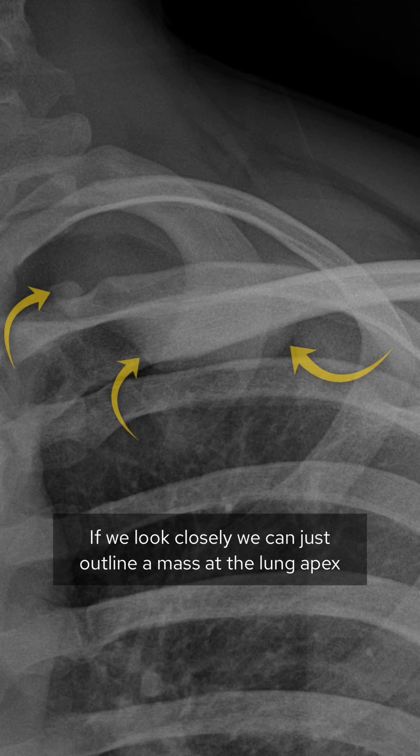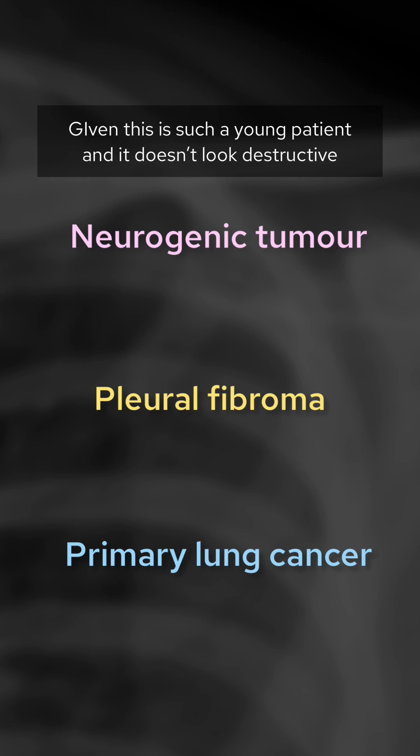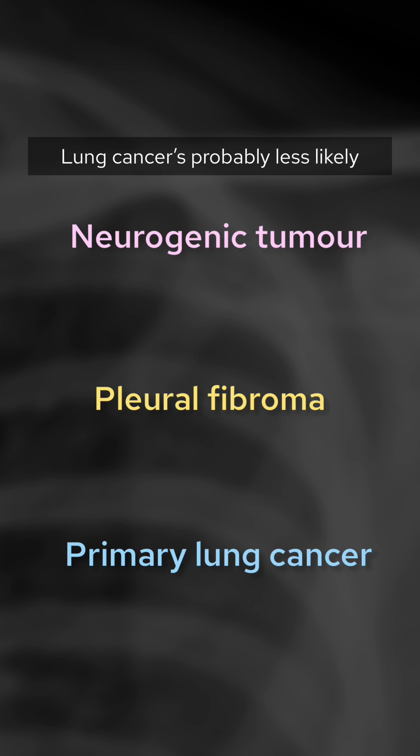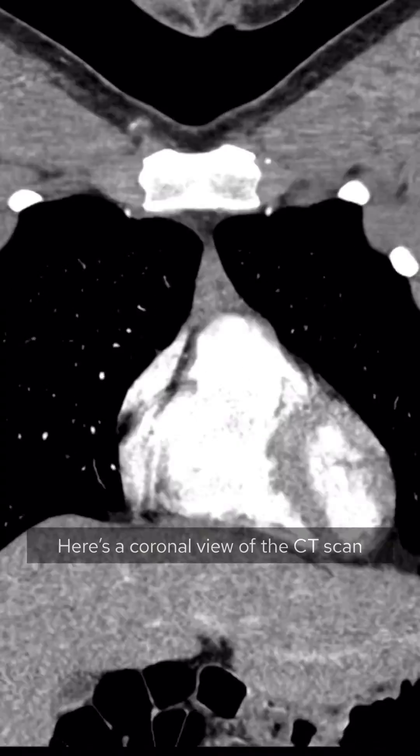If we look closely, we can just outline a mass at the lung apex. This doesn't look destructive — all the ribs look intact. Given this is such a young patient and it doesn't look destructive, lung cancer is probably less likely, but we should consider a neurogenic tumor and a pleural fibroma.